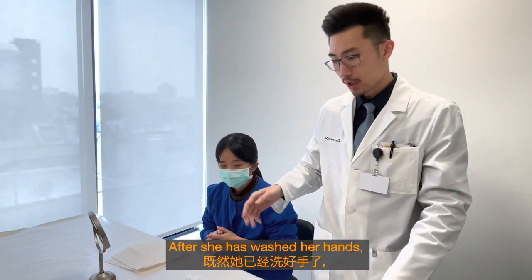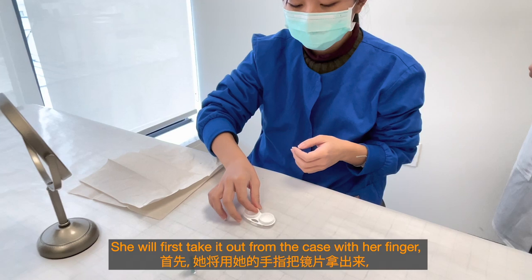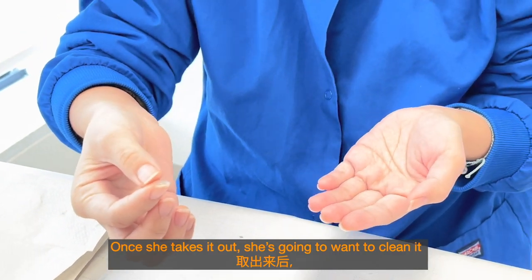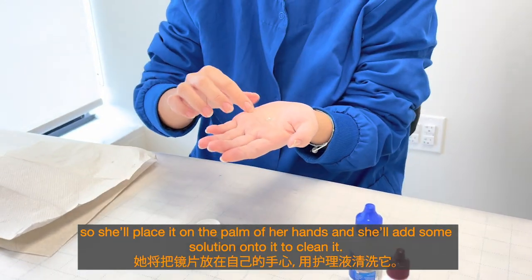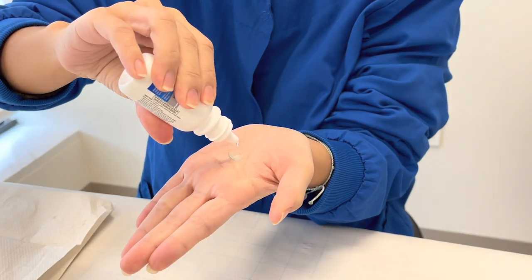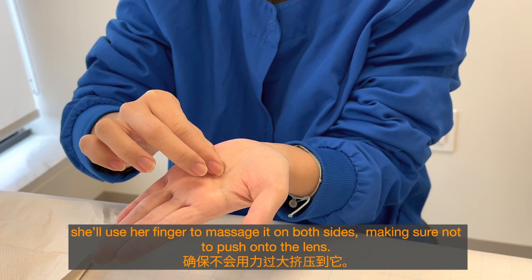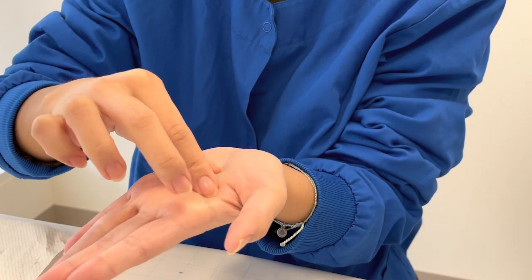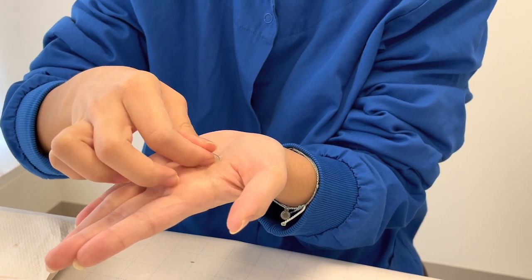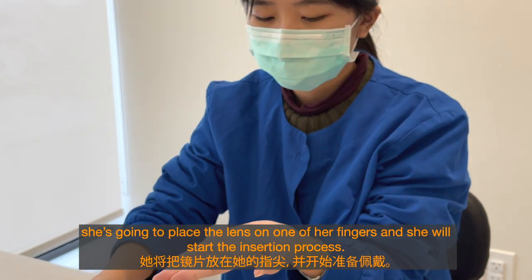After she has washed her hands, she will take the lens out from the case and then clean it. She will first take it out with her finger, making sure not to push onto it so she doesn't break it, as they are fragile. Once she takes it out, she'll place it on the palm of her hand, add a few drops of solution, and use her finger to massage it gently on both sides. Then she'll place the lens on one of her fingers to start the insertion process.